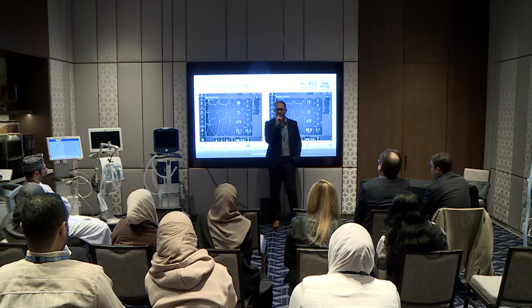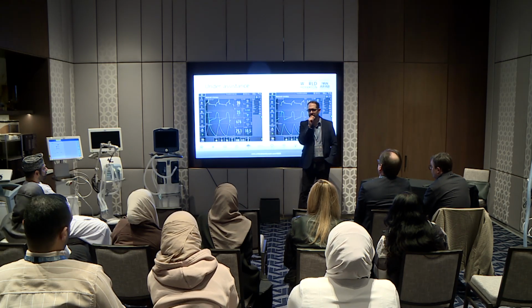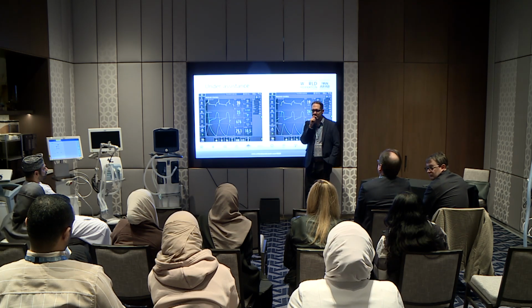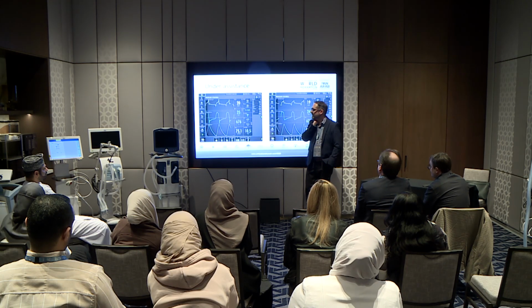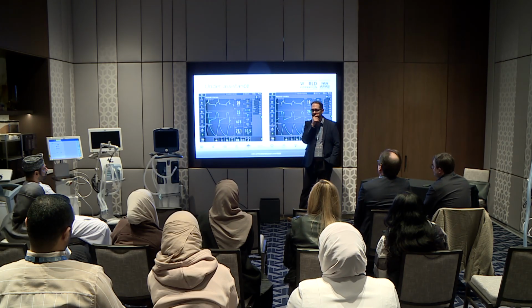The cycling. Is it short cycling? Is it late cycling? Is there an issue with cycling? Short cycle because flow starvation means inspiratory time is low, so it is not sufficient to get tidal volume. So it's not short cycling, it's late cycling. Why? What evidence do you see?